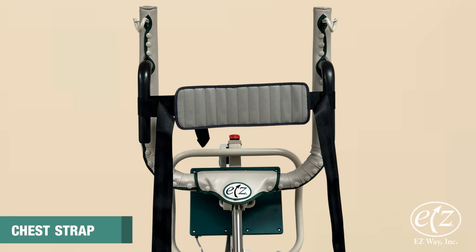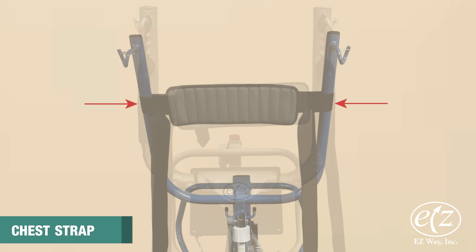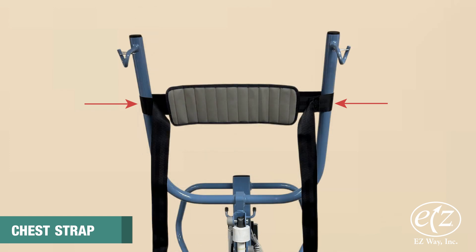The chest strap is used with easy way sit-to-stands to help keep forward-leaning people upright and to prevent them from slumping forward. The chest strap can be attached to the black padded handles on easy smart stands or to the stand arms on the classic stand.